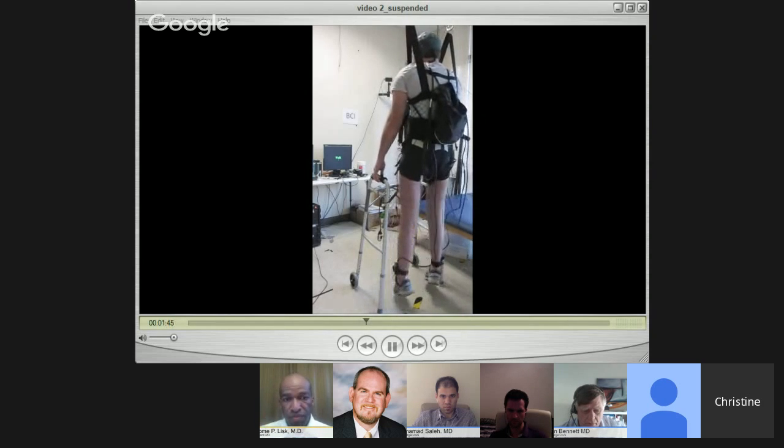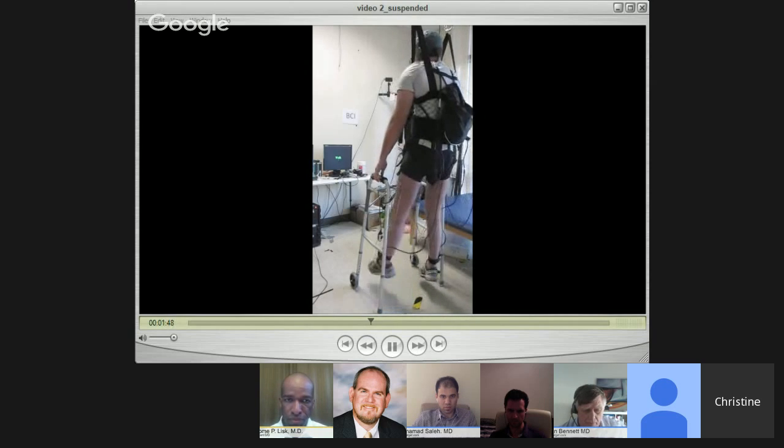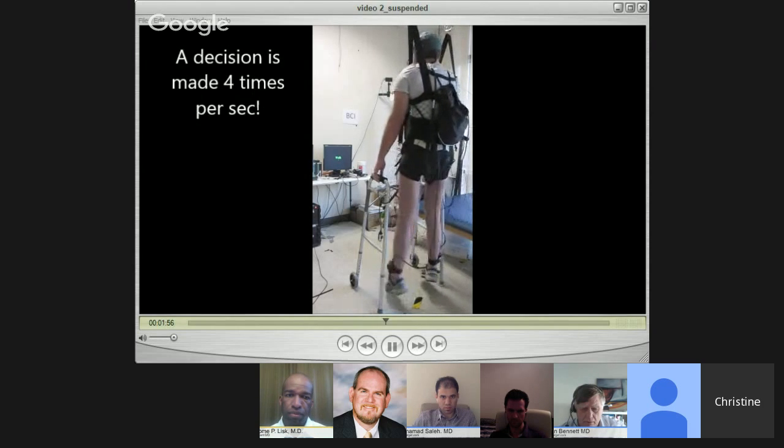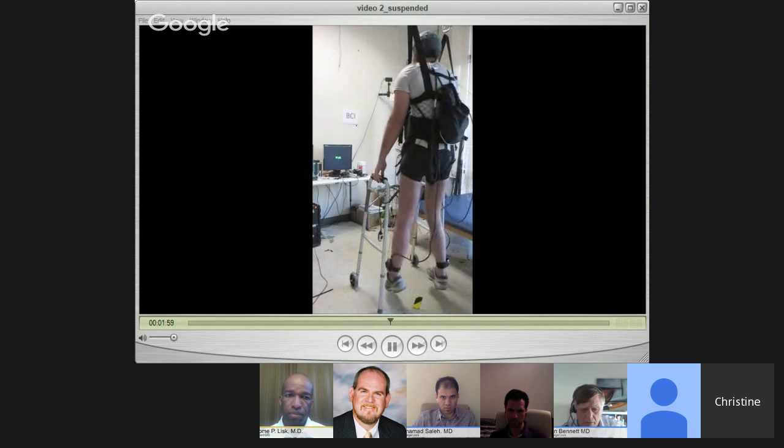What we did to understand how his walking patterns actually worked was, during his training, I basically videotaped him and figured out how to control the device so that it matches his walking pattern. Obviously, there are things like postural stability and being able to shift your weight that need to be trained during your FES stimulation training. And you have to be able to match this when he's trying to use the BCI device in real time. And one thing that's nice is this can easily be done across many individuals, as you can change these parameters and soft code them so that you have an individualized functional electrical stimulation pattern for each individual based on how they are trained.